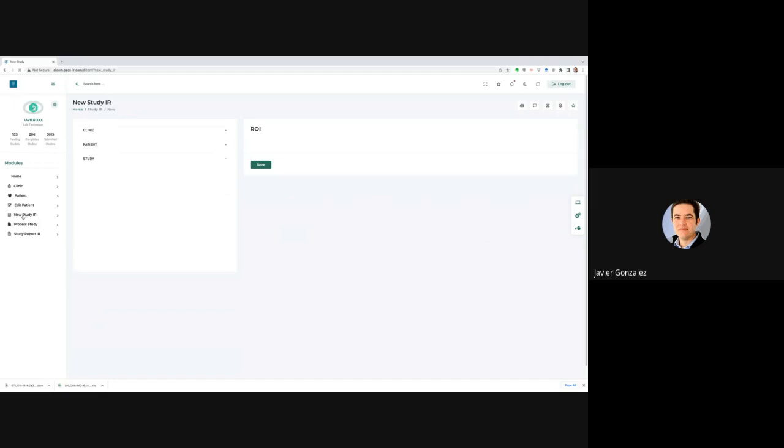Yeah, I think his intentions are good. He wants to put a nice platform out there. The thing is that the way he's doing it, it's not in our best interest because he's supporting three different versions of the same thing. So if we share information among us, it's going to come down to who has the better programmers, because all of us will have the same ideas, right? Yeah, it's not like there's a whole lot of new things. Thermal imaging is the same as it's always been. It does what it does.